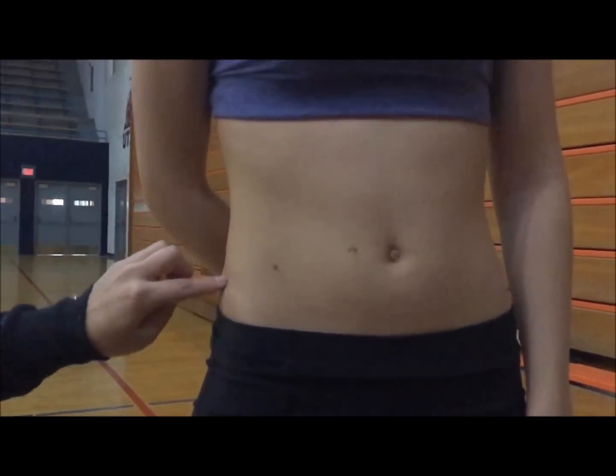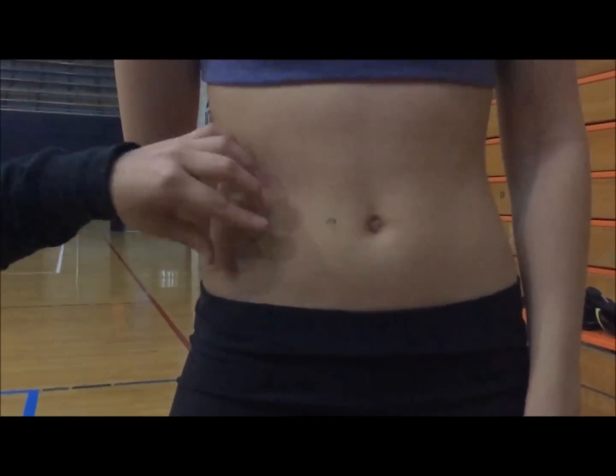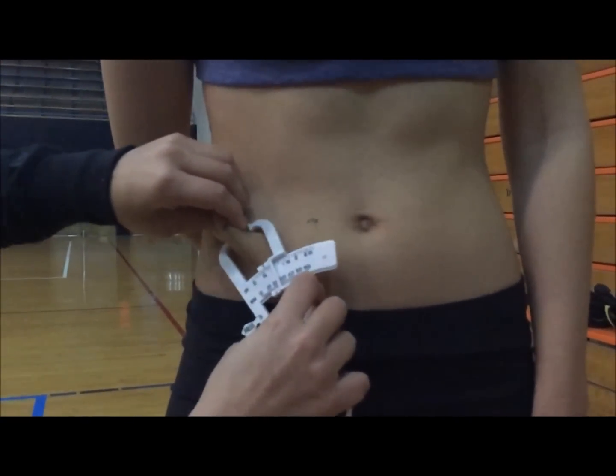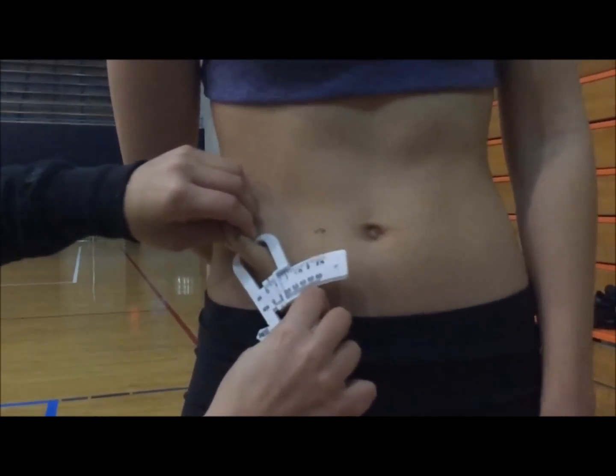Next, we will be doing the suprailiac, which is a diagonal fold. Make sure you separate skin from the muscle, maintain the pinch, and take your reading.